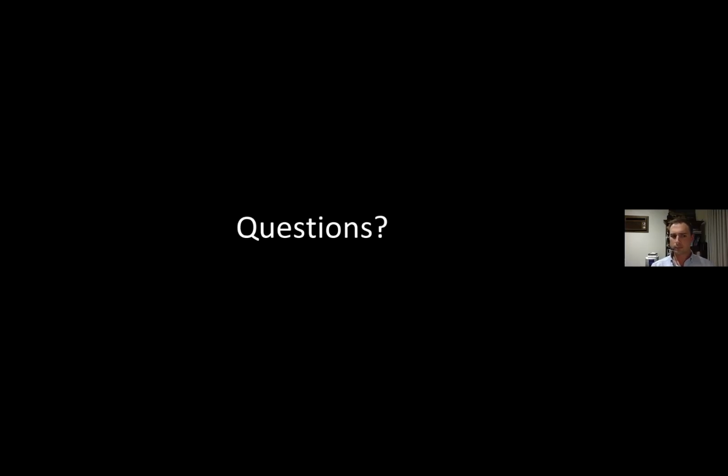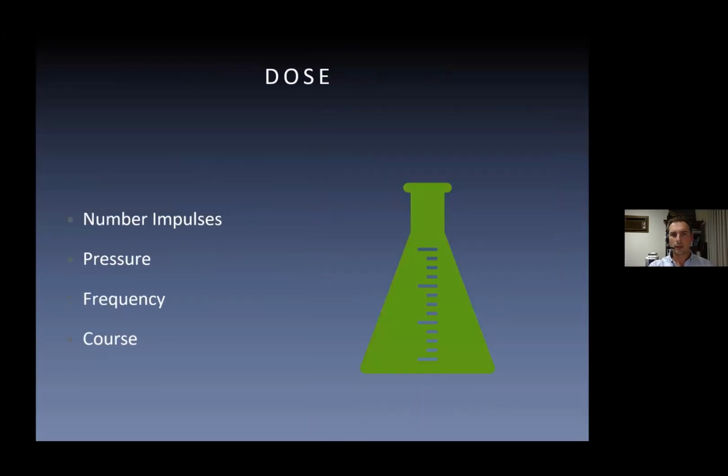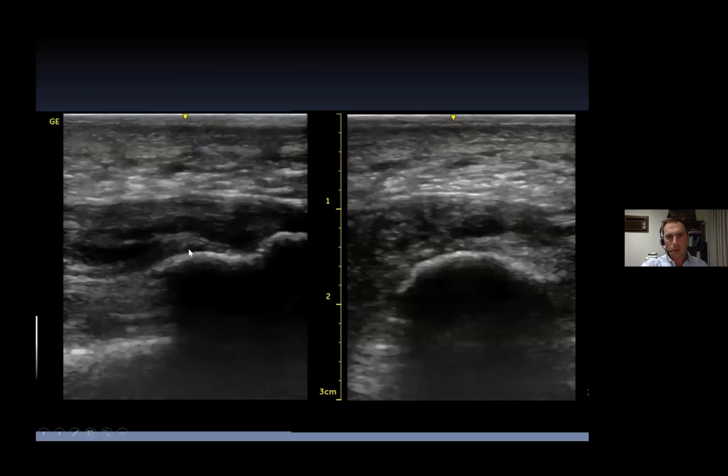How does shockwave play out in the treatment of heel spur issues? Look, shockwave I use very frequently for heel spur issues. So let me just go back. What I'm going to do is go back to a slide. Okay, so this is an ultrasound here. This is a heel spur.